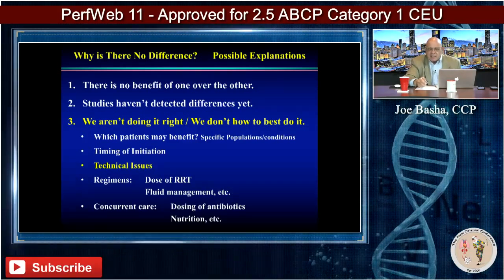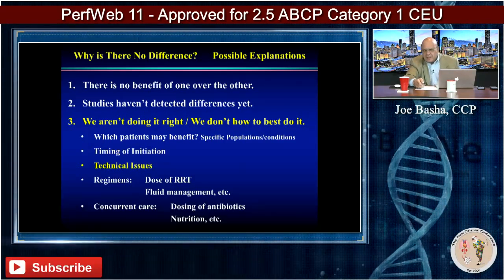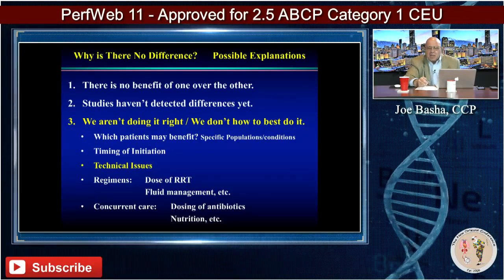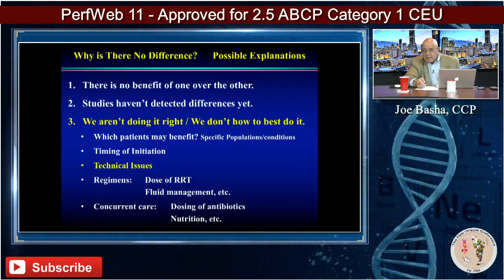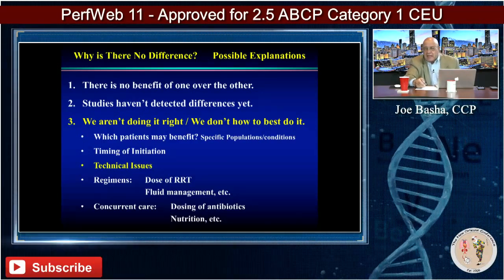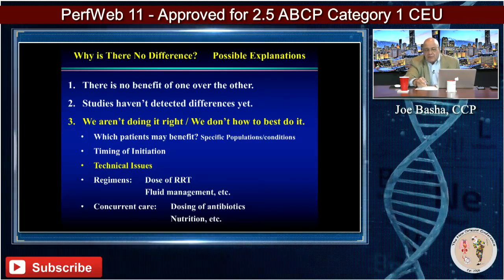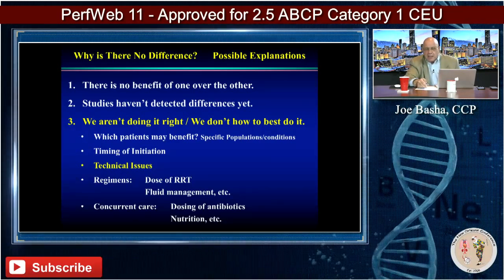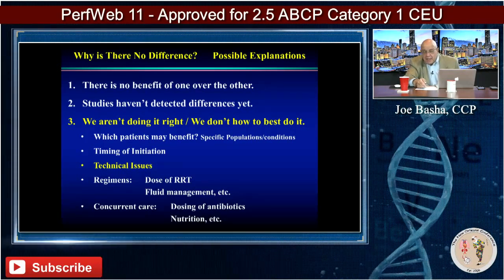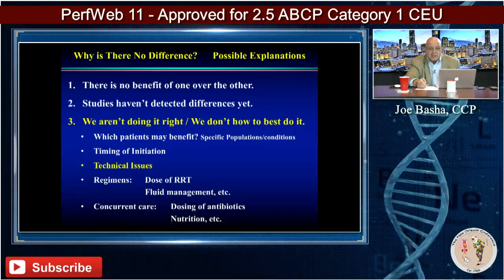There are studies that show there is no benefit one over the other, CRRT versus intermittent dialysis. Some of the studies have not detected a difference yet. Now, why is that? Well, there are reasons. I'm going to talk about them. One of them, however, could be we just don't do it right, and we don't know how best to do it, which patients may benefit, which ones may not, so specific patients and conditions.